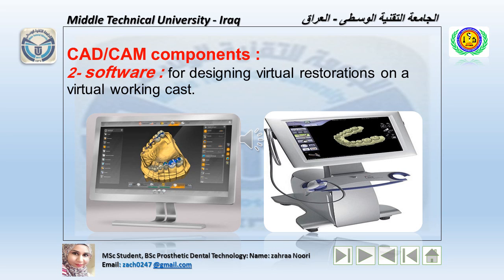The scan data is converted into a format that allows the three-dimensional image to be utilized by the selected treatment planning software. Then, if the computer settings are correct, what is planned in the software is ensured of perfect reproducibility in the manufacture process and consistency in the result.